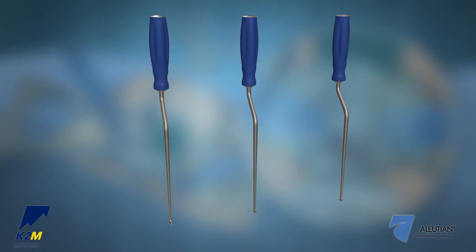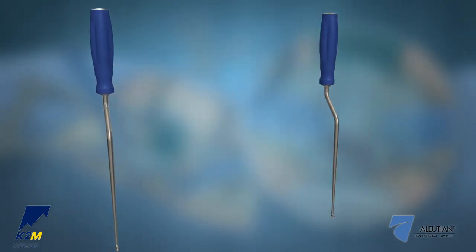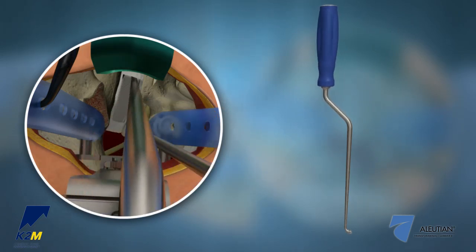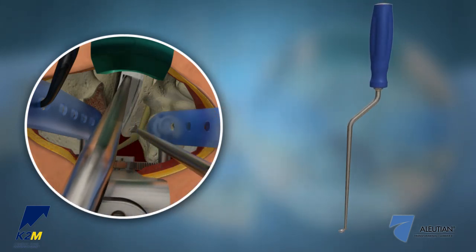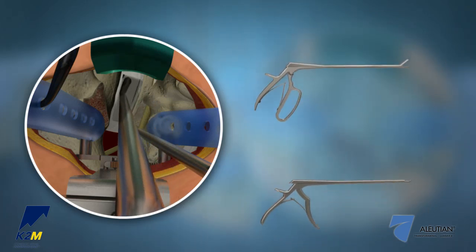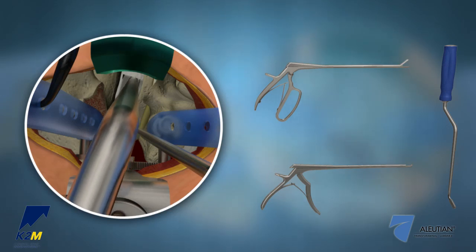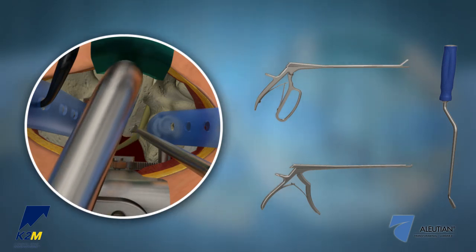The Aleutian T-Lift II System offers curettes in both straight and bayoneted designs. The bayoneted curettes provide optimal visualization when used with the TerraNova system. A variety of pituitaries, Kerrisons, and rasps are also available to help prepare and decorticate the vertebral endplates before inserting the interbody.